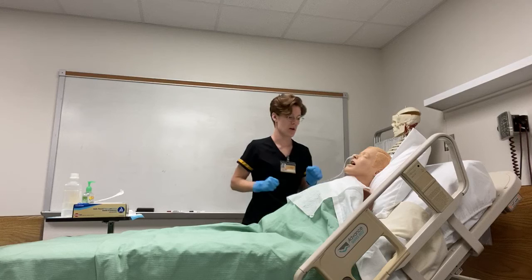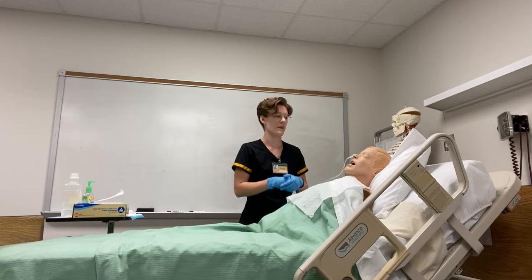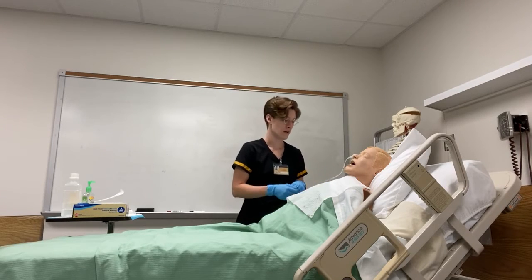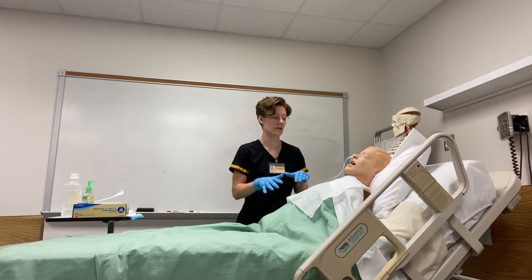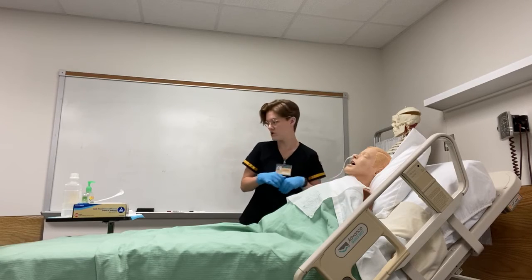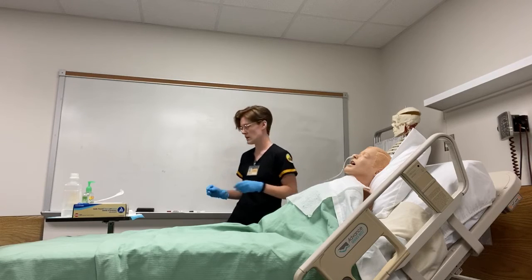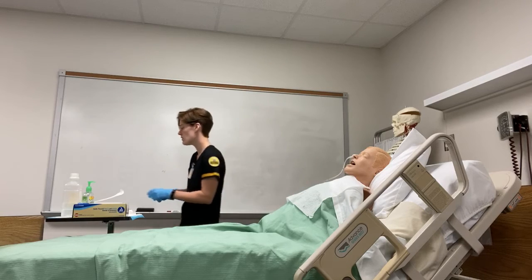And then I would also send my patient off to x-ray to ensure that the tube is placed correctly. If I did not have the option to send the patient off to x-ray, I would just aspirate the stomach contents and check the pH. And so now that I've gotten the patient back from x-ray, the tube is placed correctly, I can go on to my med administration. So with this, I'm just going to be checking with my EMR to make sure I have the right medication for the right patient, right dose, route, and time, and everything does match up. So that means I can go ahead and continue to administering the medication.